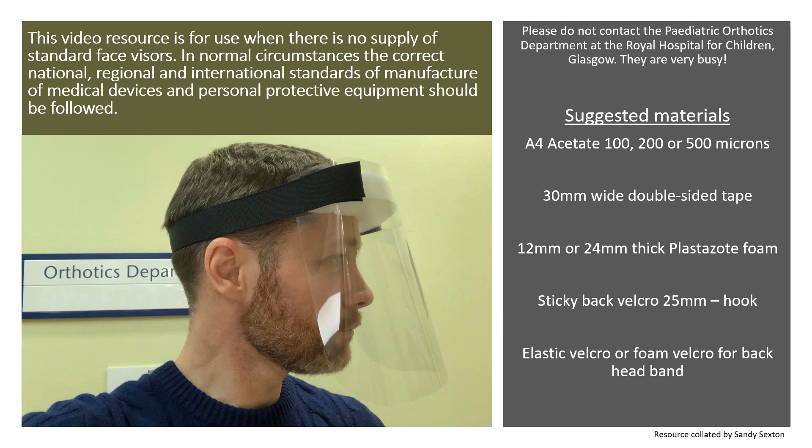This video resource is for use when there is no supply of standard face visors. In normal circumstances, the correct national, regional and international standards of manufacture of medical devices and personal protective equipment should be followed.